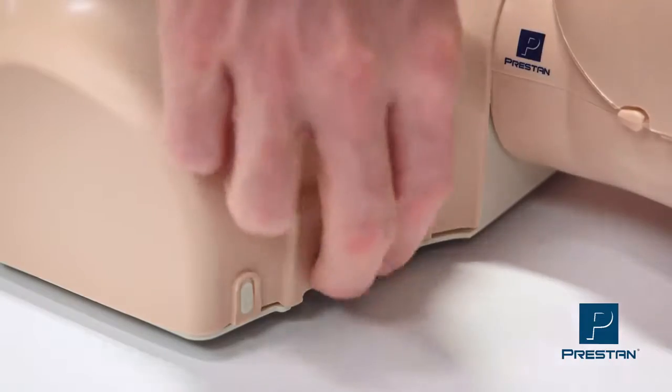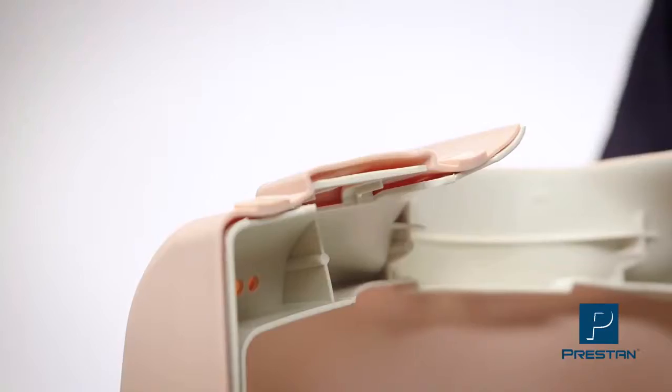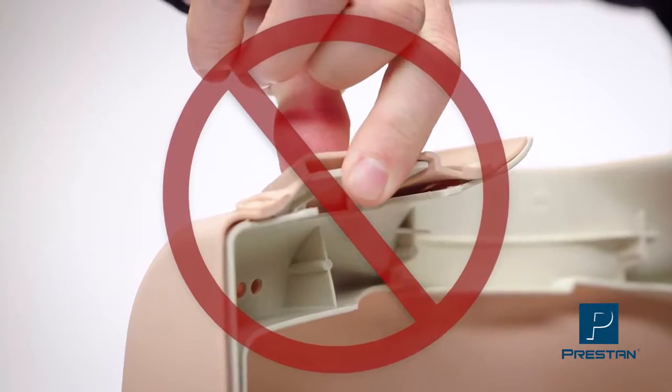First open the torso by gently releasing the tabs at the shoulders. Remember not to pull hard or overextend the tabs, as this may stretch the plastic over time, compromising the tabs' ability to lock.